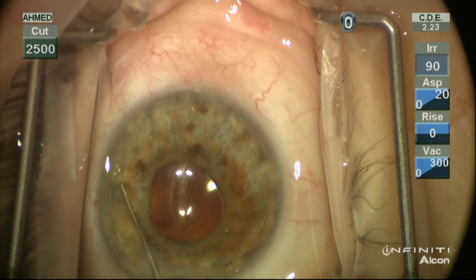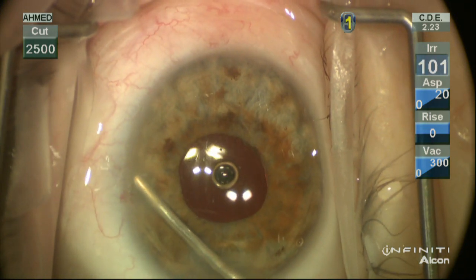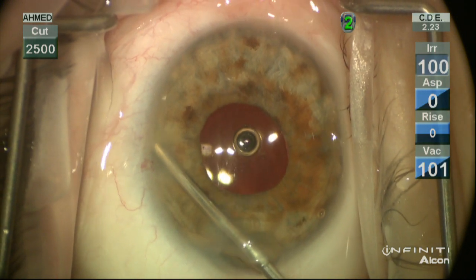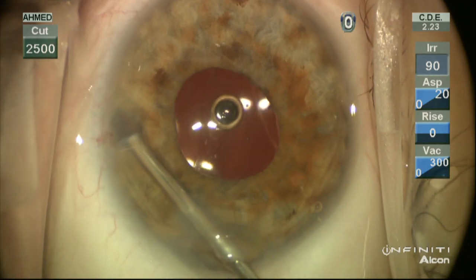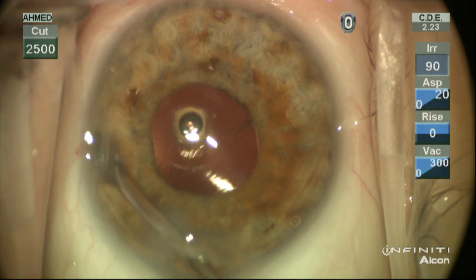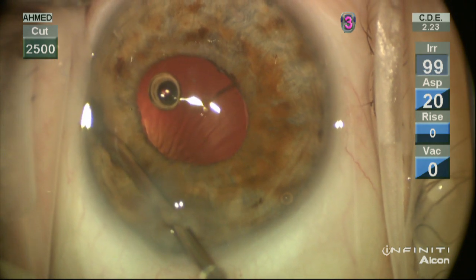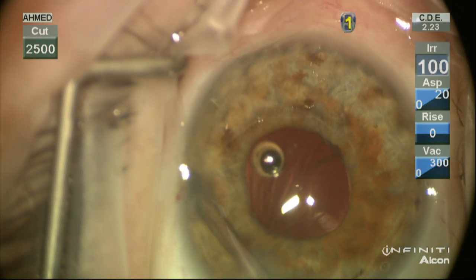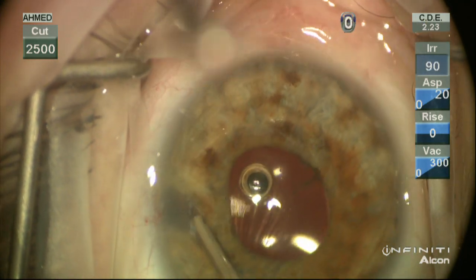This patient has a history of malignant glaucoma in the fellow eye postoperatively, so we're going to stroke the iris to bring the pupil down and then use the 22-gauge cutter anteriorly to perform an iridozonulohyaloid vitrectomy. We'll enlarge the superior iridectomy already present using the cutter at positions 2 and 3, then place the cutter through that enlarged iridectomy, cutting the zonules and peripheral capsule, proceeding posteriorly to cut the anterior hyaloid and vitreous. This is somewhat of a blind procedure — we can't see where the cutter is, but we know that area is safe. We push approximately 2mm beyond the iris to reach the anterior hyaloid, go to position 3 to aspirate that area, removing vitreous in that quadrant, then return to position 2 while withdrawing.